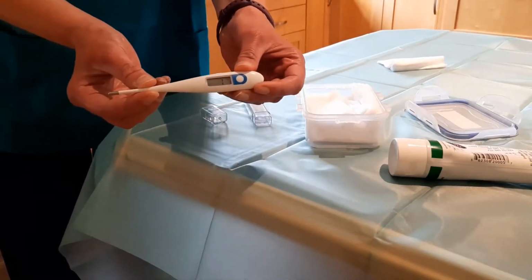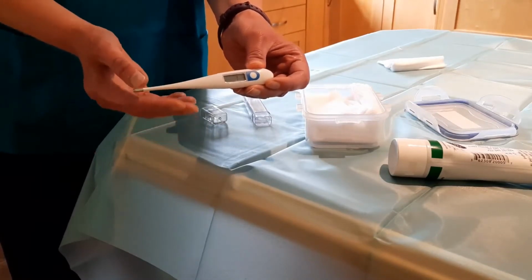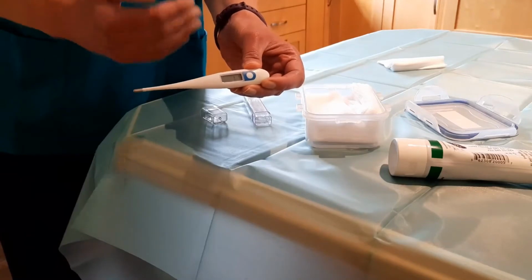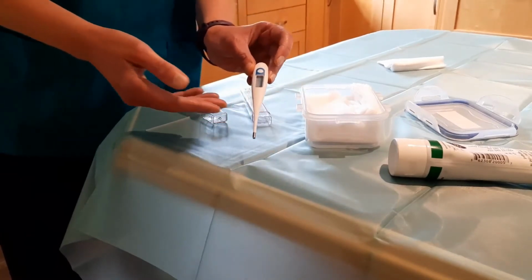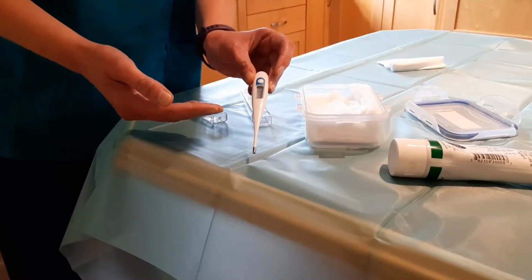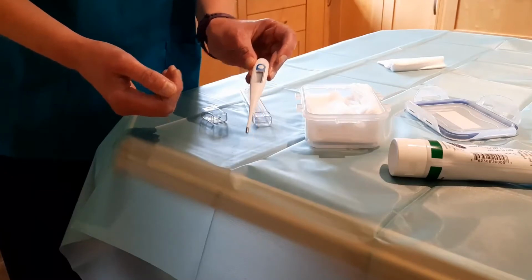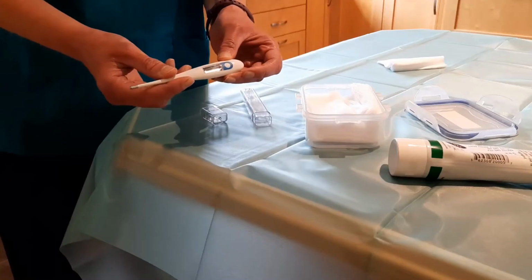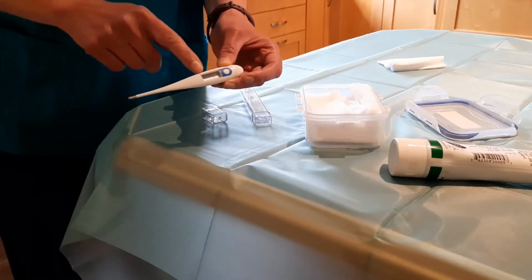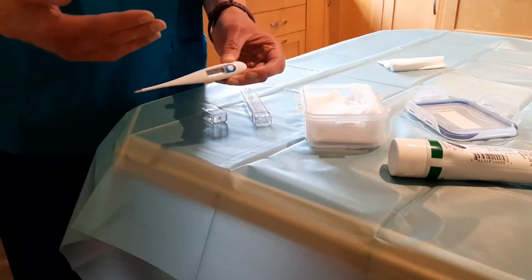This is showing L degrees Celsius, L for low. Because the thermometer isn't currently within a patient, then the temperature is below the normal body range. Most digital thermometers beep when they're ready. If the model you're using doesn't, or if it's a particularly noisy environment, then you need to give it at least 20 to 30 seconds. Keep an eye on the LCD display here, because you'll see the temperature originally climbs and then it steadies out.